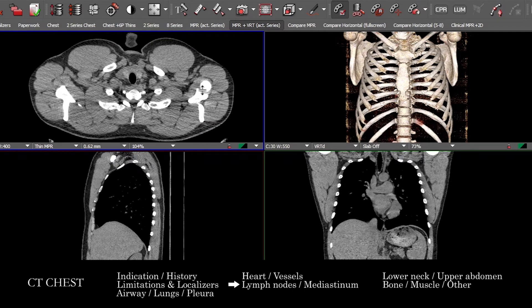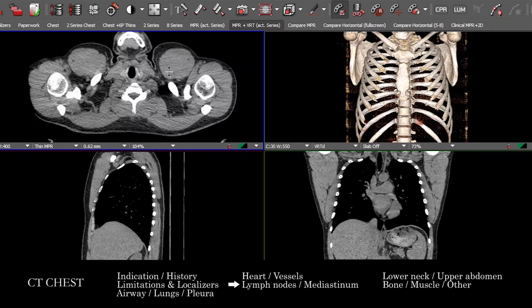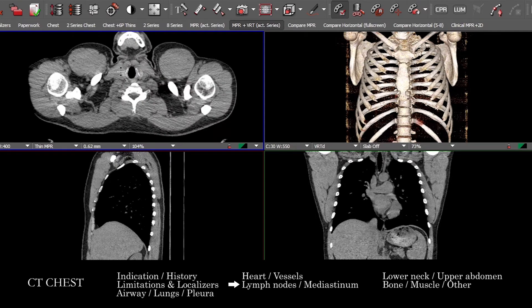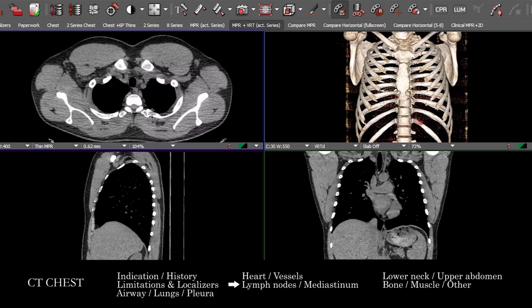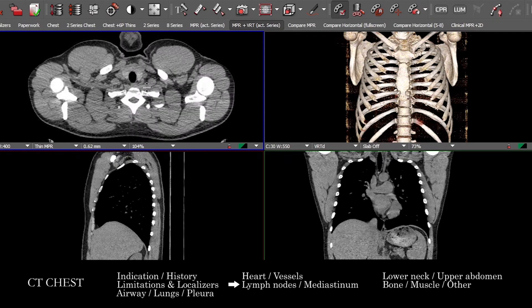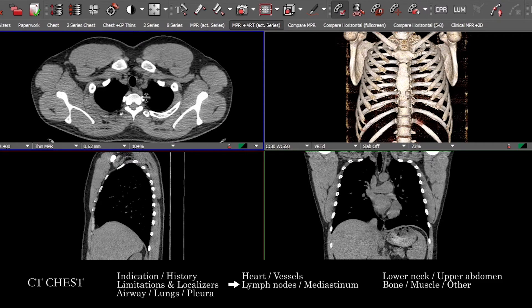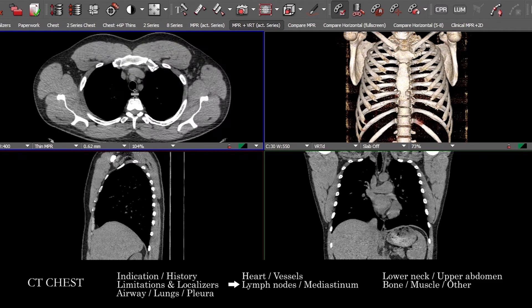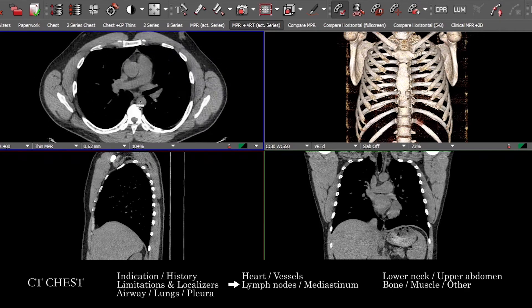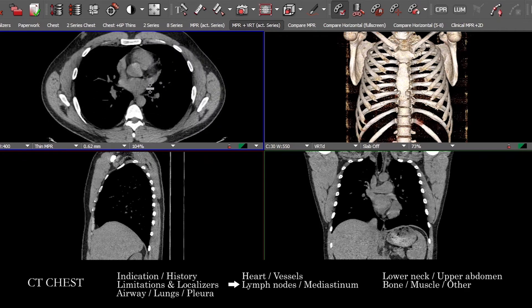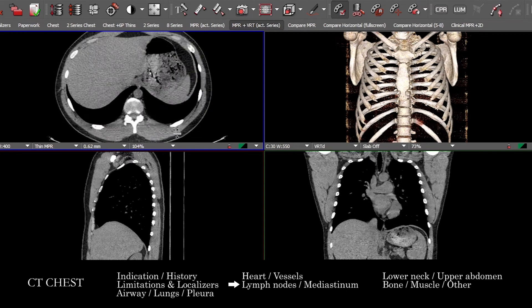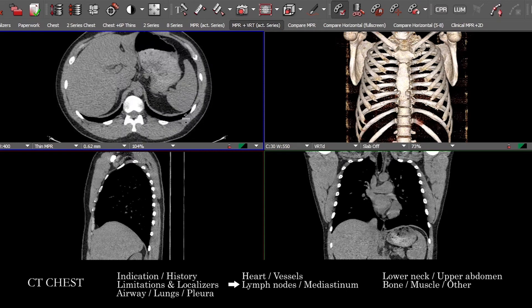Once I've taken a look at the lymph node stations, I'll look at other structures in the mediastinum. We're going to see part of the thyroid gland and what we can see of it — looking for nodules and mass lesions — and then following the esophagus down along its entire course, trying to see if there's any sort of abnormal dilatation, wall thickening, mass lesions, or involvement from other pathologic processes.